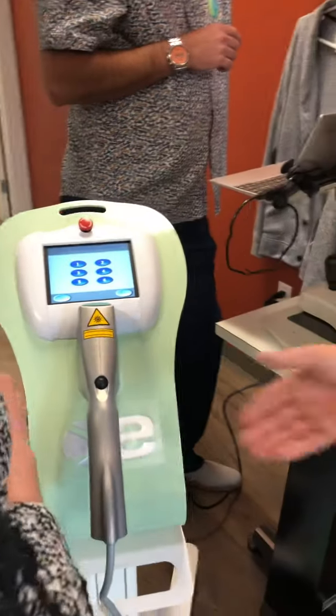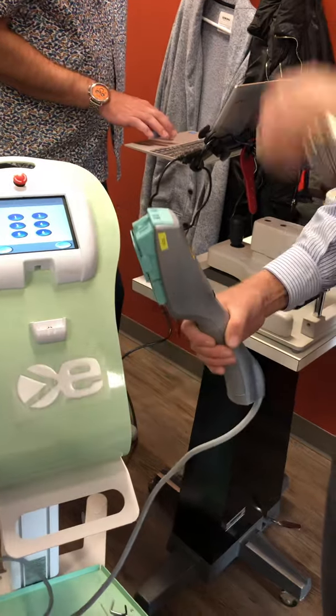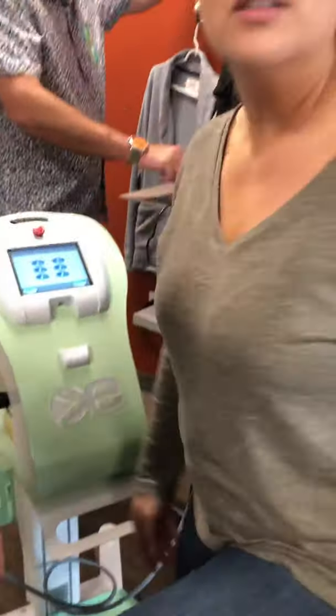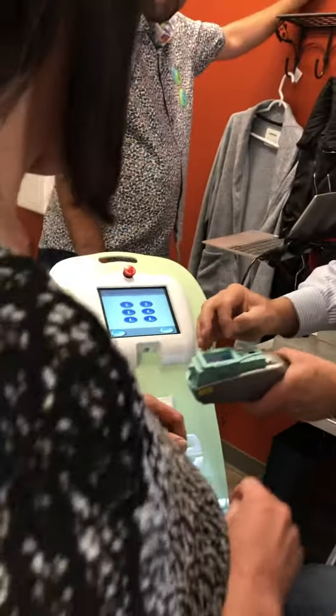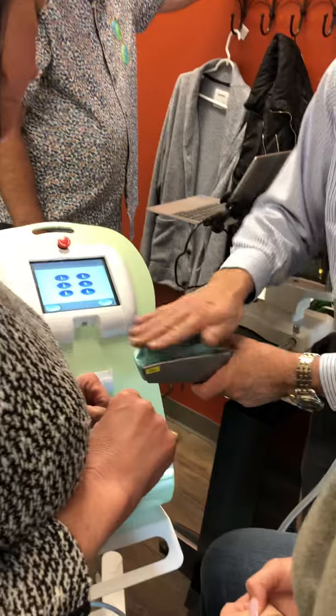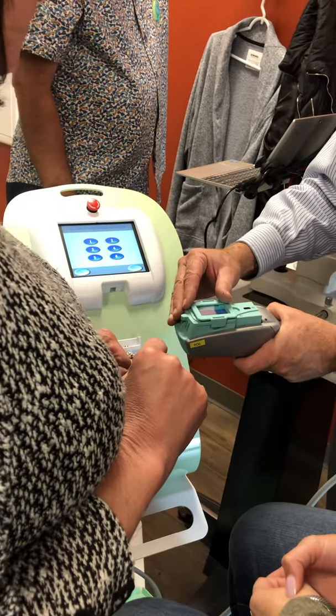Now, Celinda, come over here for a second. And actually you can bring the stool over, your makeup stool. She's going to be like as if you walk in someplace, okay? And what I want you to do is that on the IPL crystal, this will be brand new, so we don't have to necessarily wipe it down, but here's where you could wipe this with an alcohol wipe.